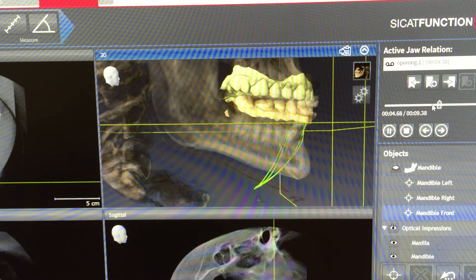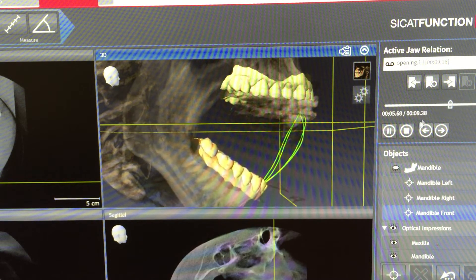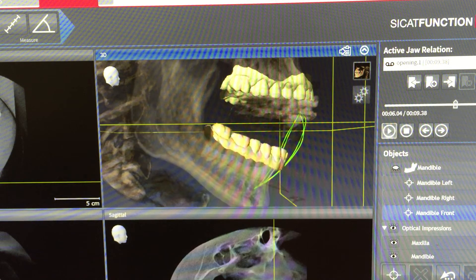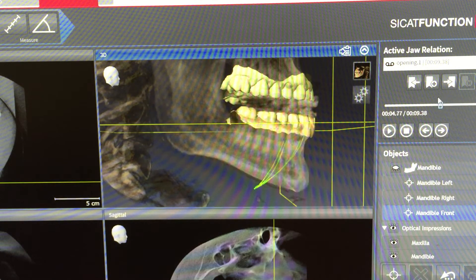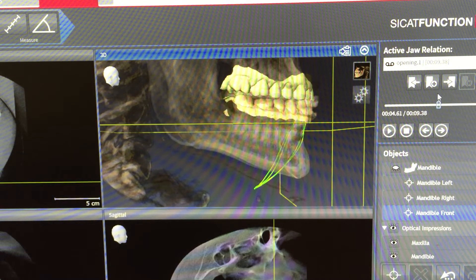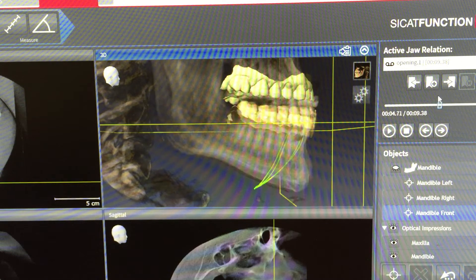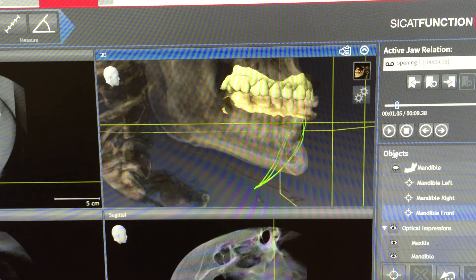We can see where the bite is, and where the bite is most ideal for this particular patient. For instance, the patient is decompressing around this point where we chose a clean pattern of closure.